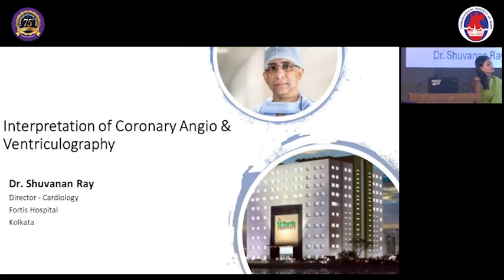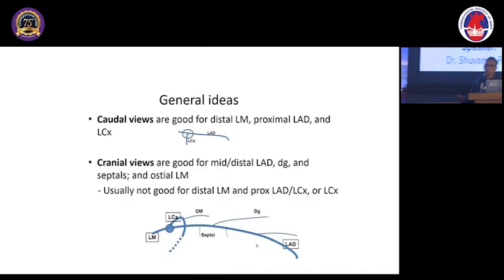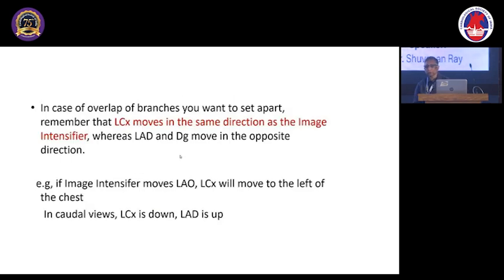The point is, we do coronary angiograms, and when we see coronary angiograms in a CDI, I do not see LV angiograms mostly. So my question to all my students and all the delegates here: do you think that LV angio should not be done? It is superfluous. Should be done if required, not at all done. So I think an angiogram is not complete if you do not do an LV angiogram, as simple as that.